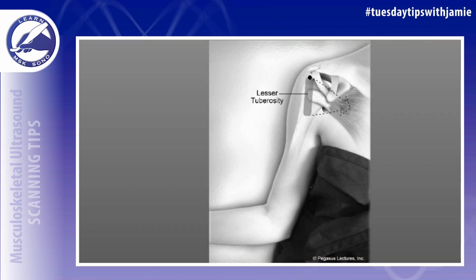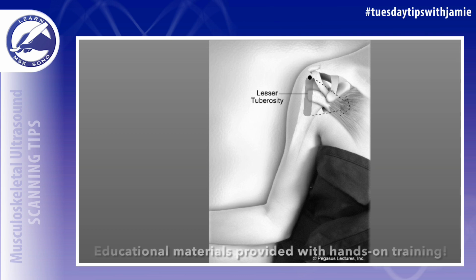If you want to learn how to scan the rotator cuff on ultrasound, I can give you MSK ultrasound training. It is important to learn the appropriate scan techniques and protocols for each MSK exam to be able to provide diagnostic images. MSK ultrasound is emerging as a valuable tool in the evaluation of musculoskeletal injuries, but must be performed by a trained clinician.